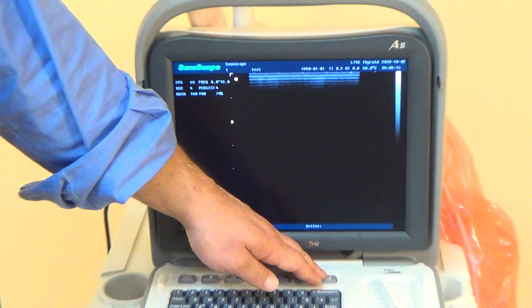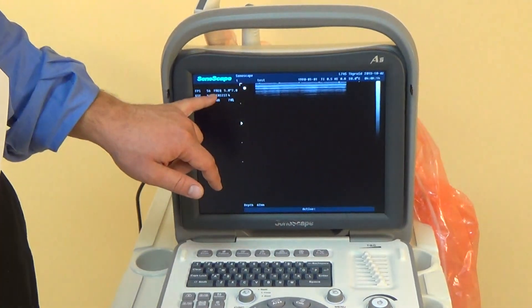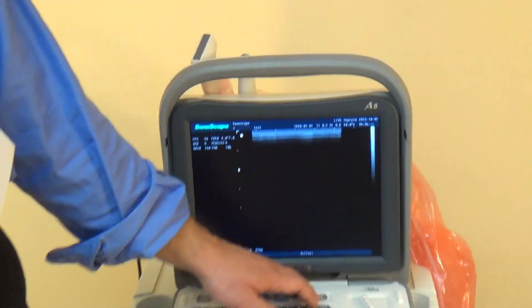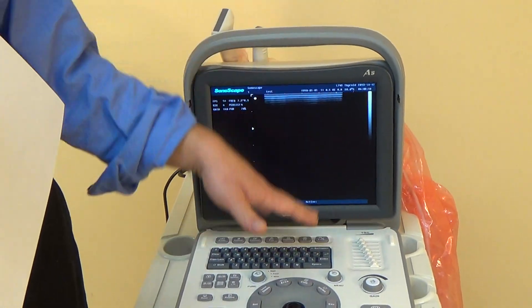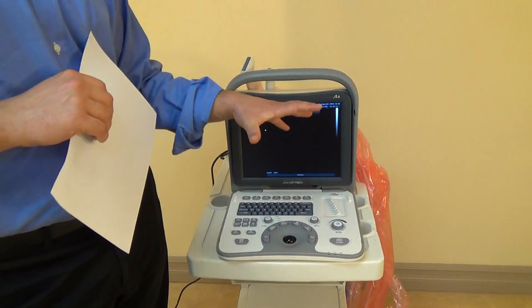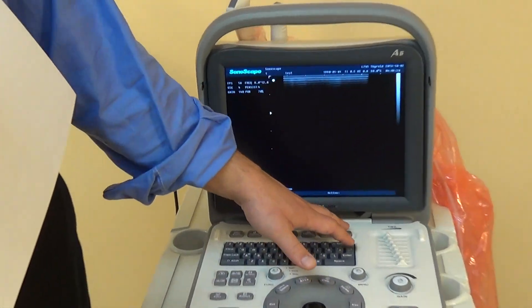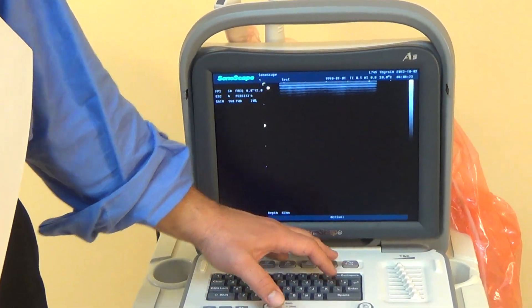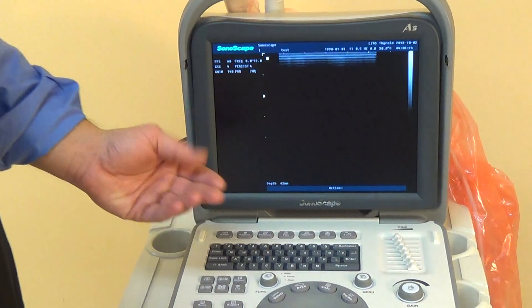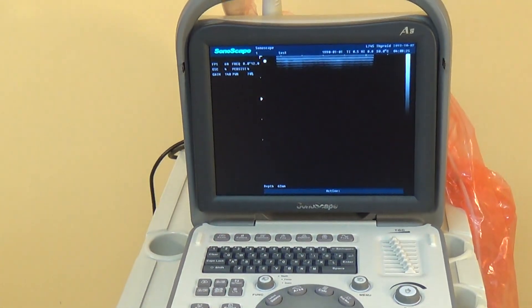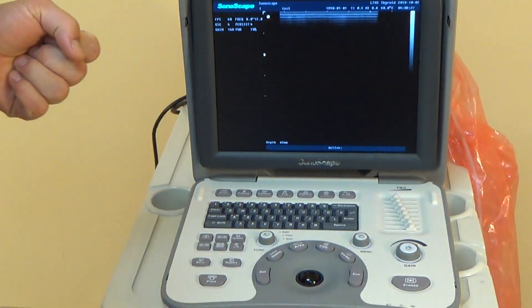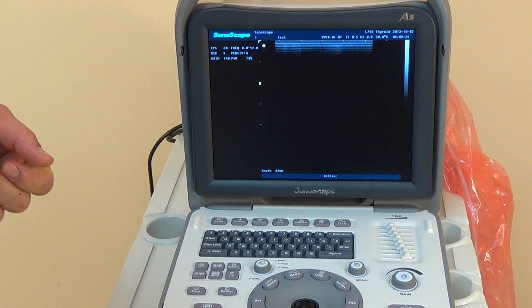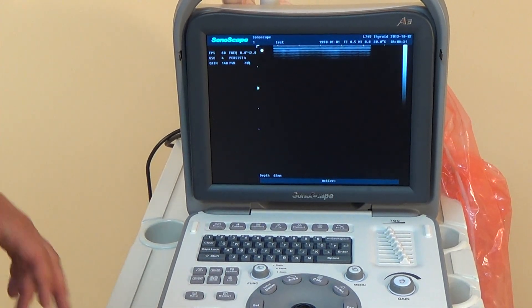Finally, there's a frequency button that changes the frequency number displayed. The lower the frequency, the deeper you can penetrate into the tissue, but the less clear the quality and resolution of the image. The higher the frequency, the sharper and more detailed, but you can't go as deep. So it all depends on what you're looking at specifically.